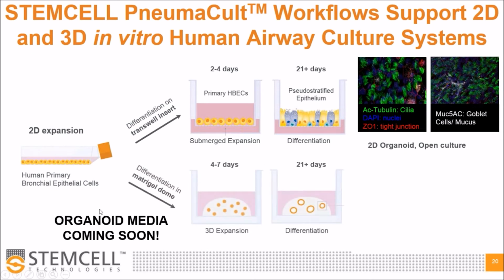Another system that is under development, and will soon be available, consists of the differentiation of human primary bronchial epithelial cells into a 3D Matrigel-based system forming organoids.